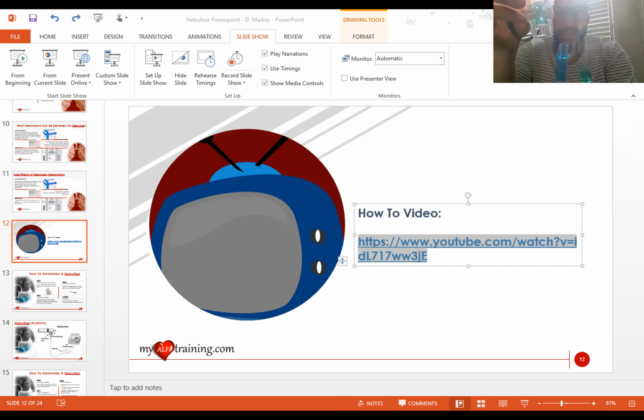And here they have it color coded for you. So blue makes the blue. And the green will go to the wall. And if you look at the wall oxygen port, it's also green. So that way we can't make a mistake. And place the mask on our patient. I'll show you guys here. Affix the oxygen tubing to the bottom portion of the nebulizer and place the mask on our patient. And we affix this to the wall.